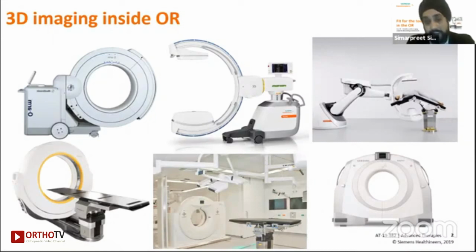You can coexist the CT between two rooms, one on the diagnostic floor, and the other one inside the OR. And there are also certain solutions available, such as a robotic cath lab, which can coexist between multiple users like cardiology, interventional radiology, orthopedics, spine, neuro, all of them can coexist with this system. What we're going to focus on today is more on the 3D imaging that we get on mobile C-arms.